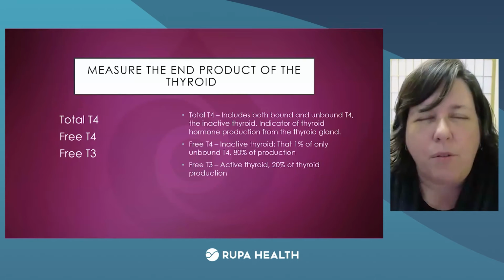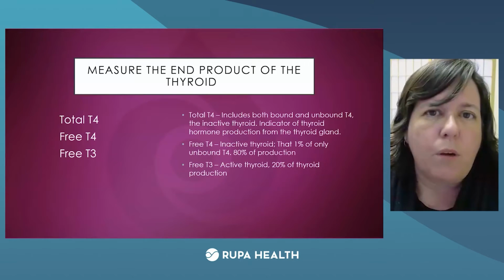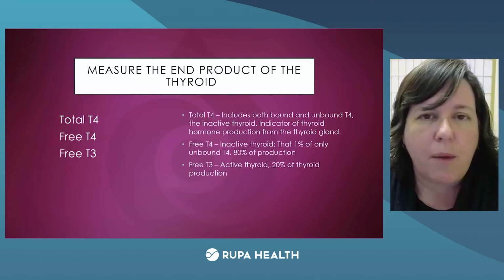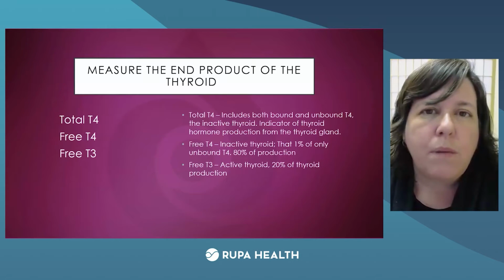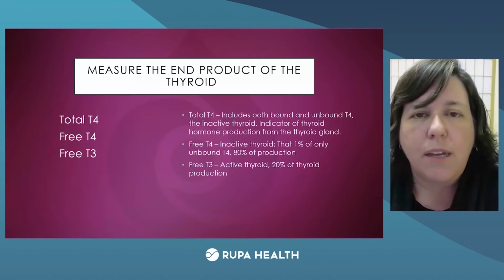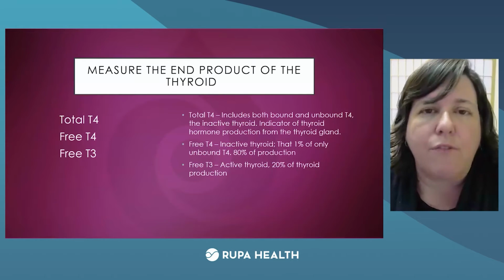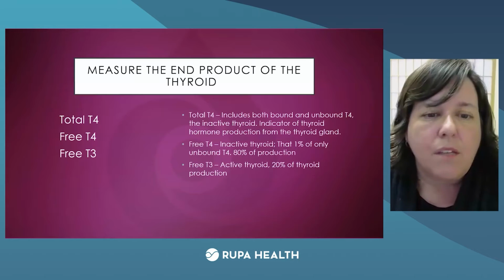When we look through some cases, I'll show you where I see people's levels being, because I want to talk about lower T3s a little bit, because you'll see a lot of people who will lecture suggesting that people should be at the upper 1/3 for most of their thyroids. And I would disagree with that. I find that most people who have really good thyroid function actually are at the bottom of these ranges for T4 and T3. Doesn't mean they're not getting effective. I think really what it is is they have very clean receptor sites, and as a result, they just don't have to make a lot in order to get good activity. So we'll look at that.